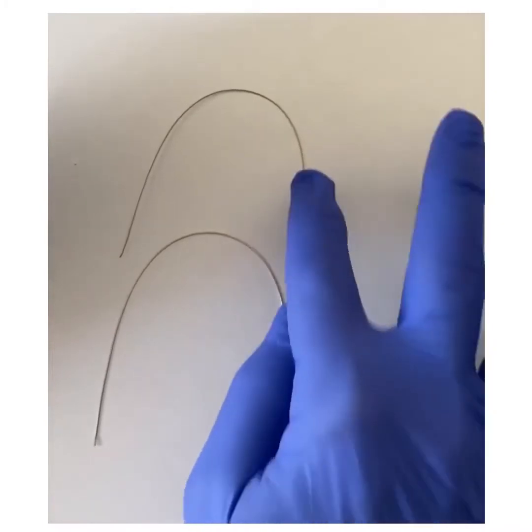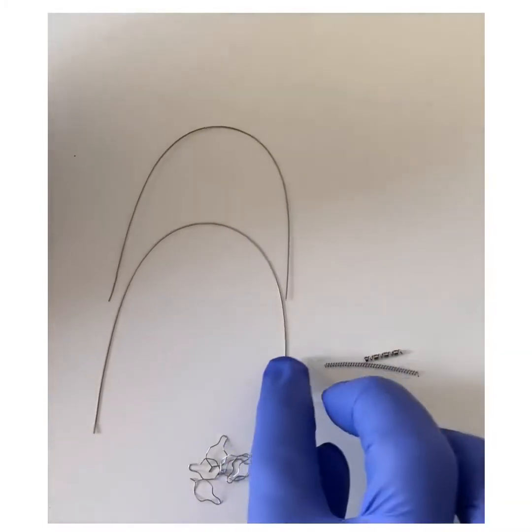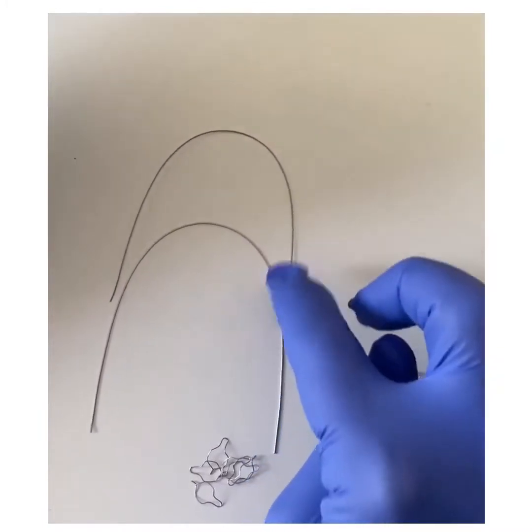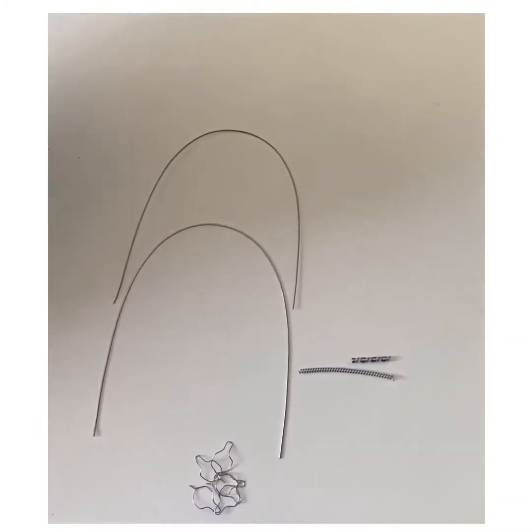There are many different metal parts that are in the mouth. Some you may have and some everyone has. These are the metal wires, these are coils, and these are metal ties.